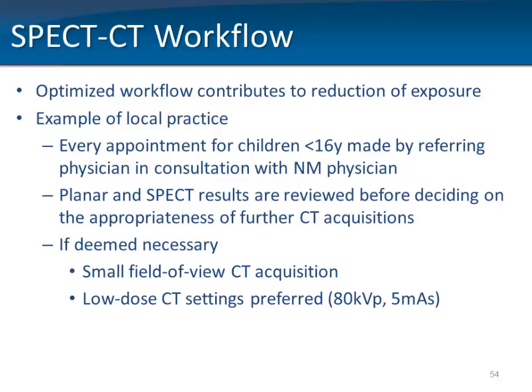So workflow can also contribute to reducing exposure. For my local practice, this means that every appointment for a child below the age of 16 is made between physician and physician. So it's not just the secretary who arranges this, and every indication has to be agreed by us before we do the study. We always start with planar and SPECT studies first, and then when the patient is on the table, we review these results before we decide on the appropriateness of a further CT study. And only if we think it's useful will a small field of view CT be acquired. And we use the settings, as I show you, that were previously published, so 80 kV and 5 mAs.